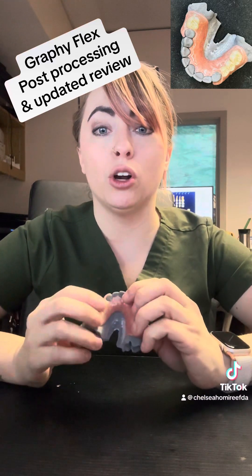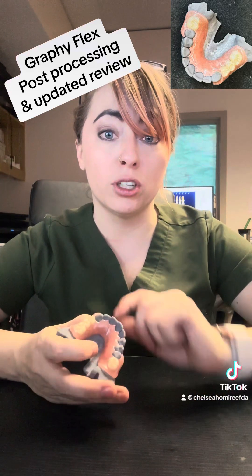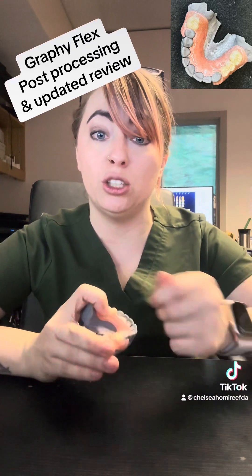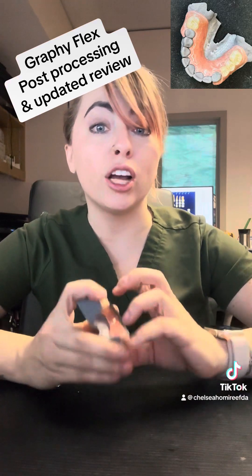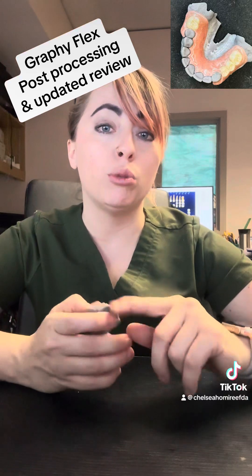The first thing you're going to do is remove your print from the build plate and then remove the supports. You want to use the smallest supports possible because you don't want to be ripping at your already fragile, not completely cured, flexible denture. Use tiny supports and remove all of them.